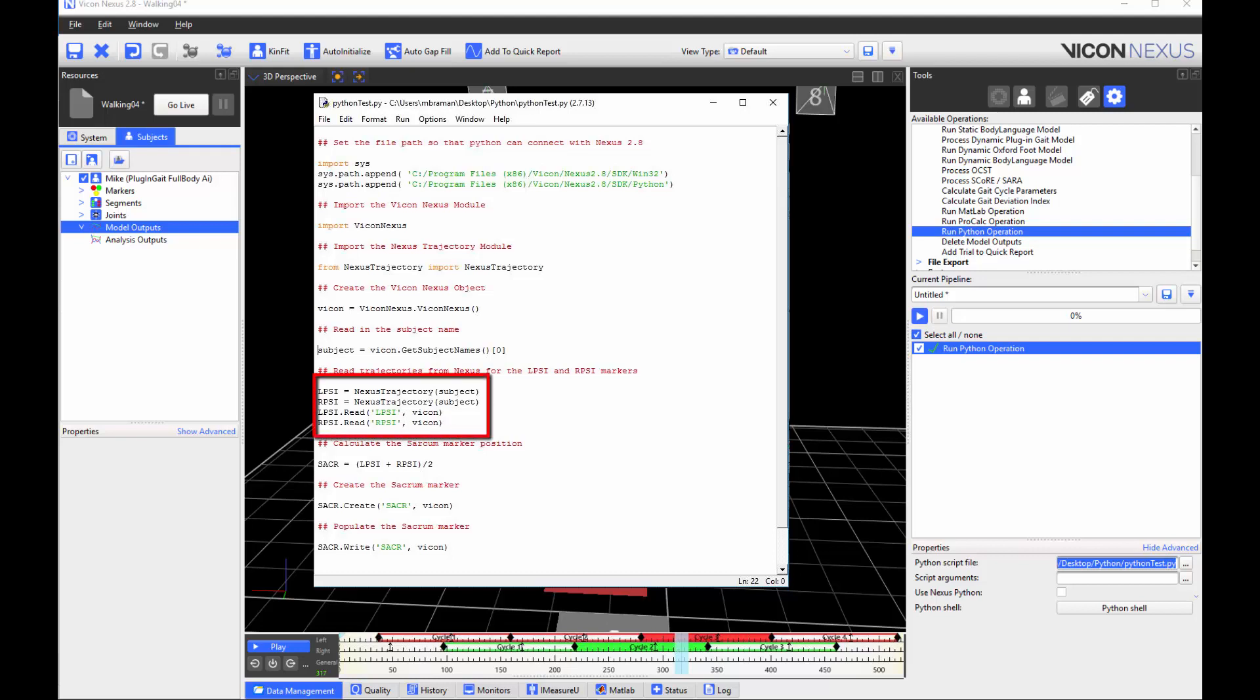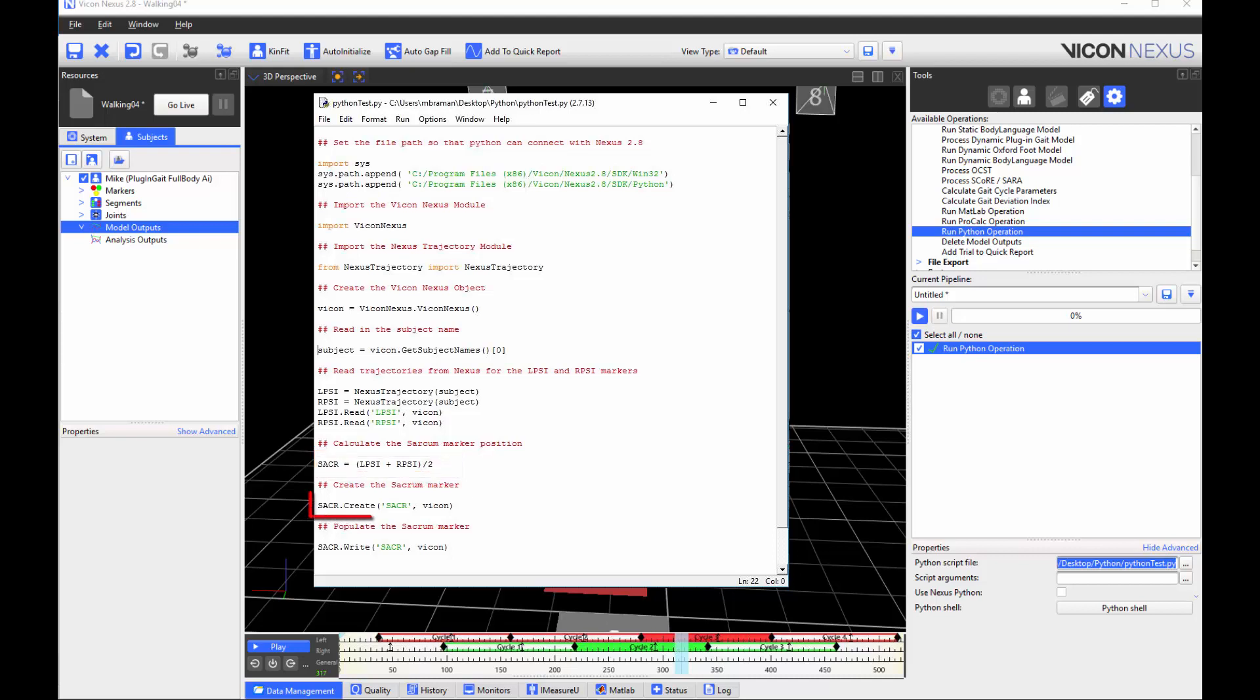After creating the Nexus object and acquiring the subject name, I will use the Nexus Trajectory module to create the LPSI and RPSI objects. I use the read function to get the LPSI and RPSI data. I use the LPSI and RPSI to calculate the sacrum position as another object, and then use the create function to create the model marker. Finally, I will populate the data in Nexus using the write function.